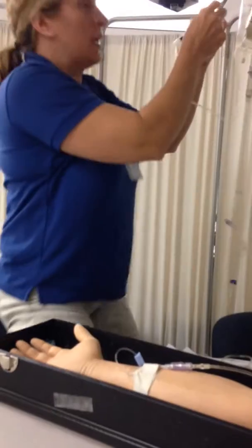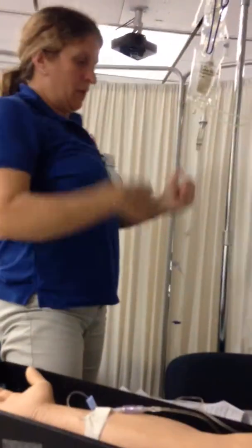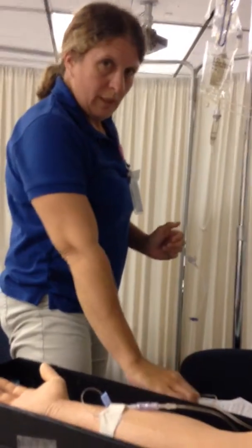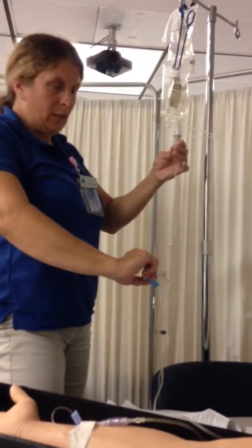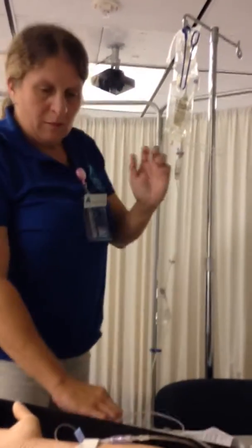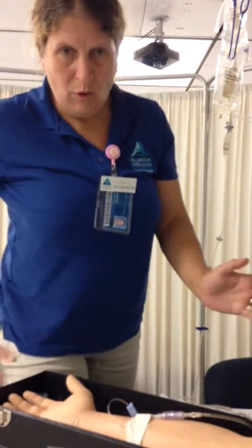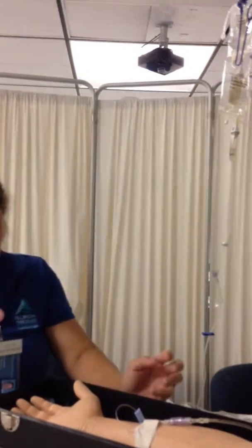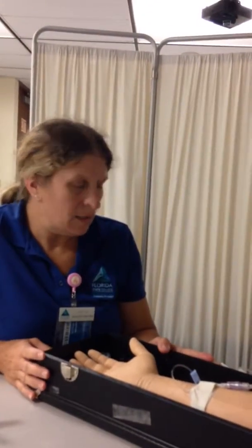I'm going to alligator clip this and hang this back up for later. And I'm going to adjust the flow rate for the normal saline that's running, and ensure that it's running at the proper dose. I'm going to check and make sure it's not infiltrating. And I'm going to ask him to give me a call if he gets any problems, pain, or redness. And that is attaching the piggyback.